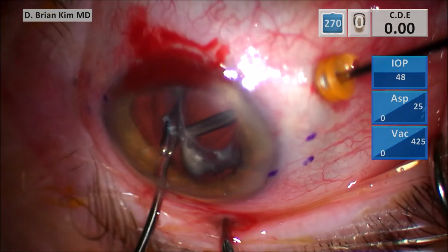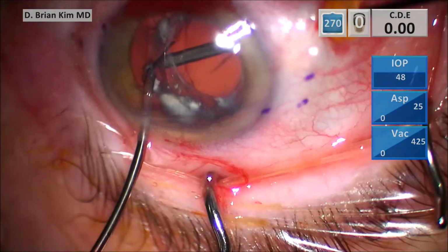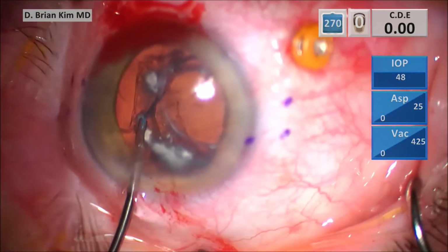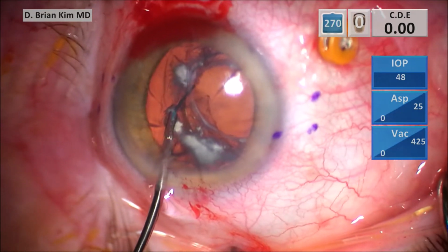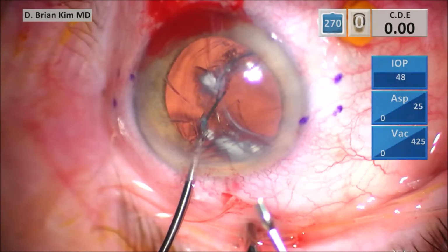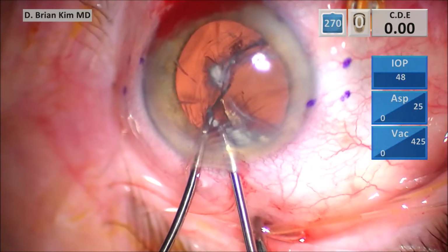I want to make sure I get a good firm grasp. So while I'm supporting the lens with the vitrector, I take another grasp, which is a good bite. And then I take the vitrector out. And then I'm going to grab with another IOL holder here. And you want to use the IOL holder because it has serrated teeth. You don't want to use something that has smooth teeth in this situation. You don't want to lose the lens.